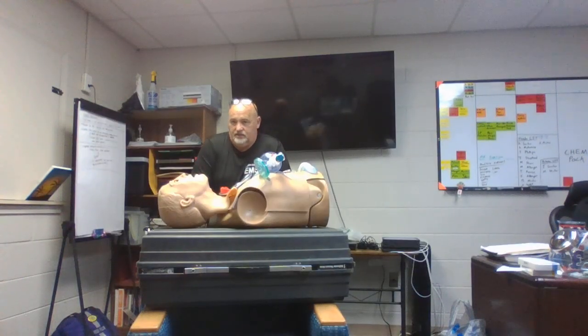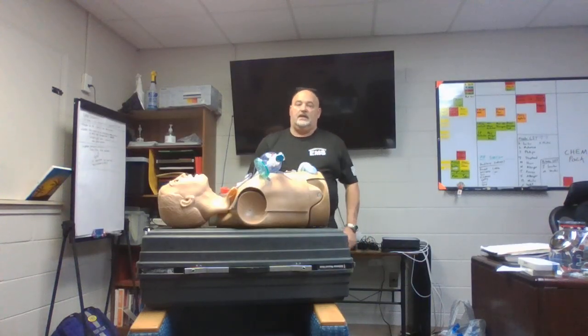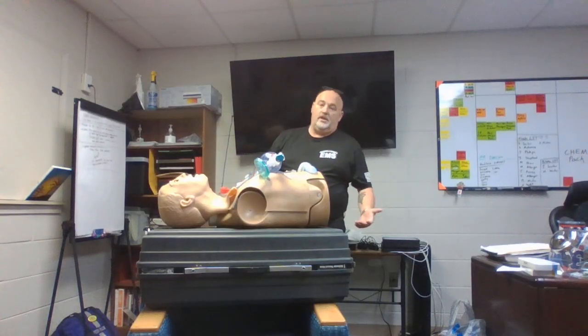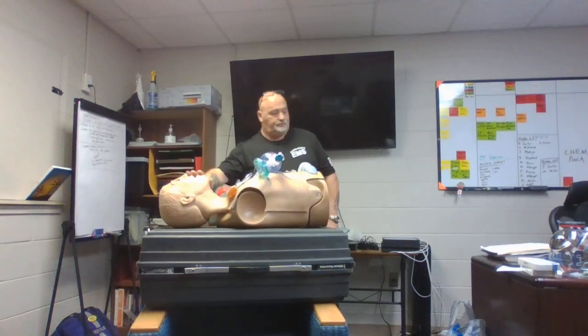If you don't pop it, causing a pneumo, you're going to put another 600 ml of air into the GI system, which is going to cause you to see really everything they've eaten in the last 3 to 4 hours. Not only are you going to get it, but it's going to go into that airway. We don't want it to go into that airway. We want to protect it at all costs. It's golden to us. That airway is one of a kind, right? We want to keep it, we want to save it, we want to savor it.